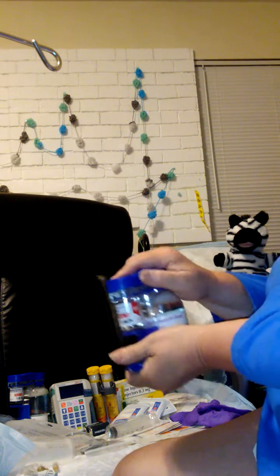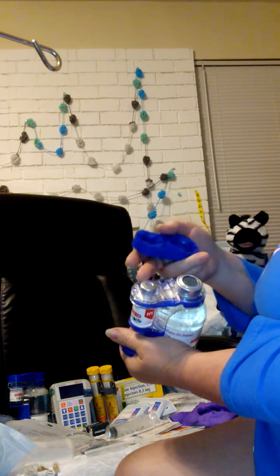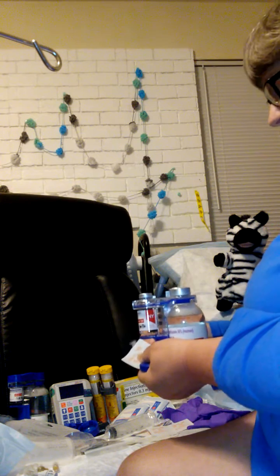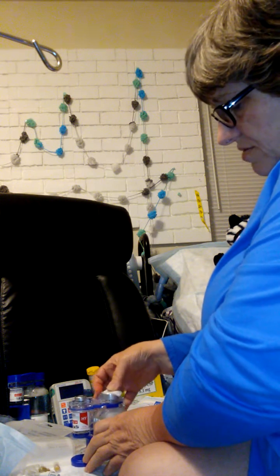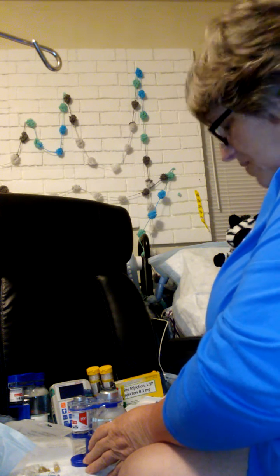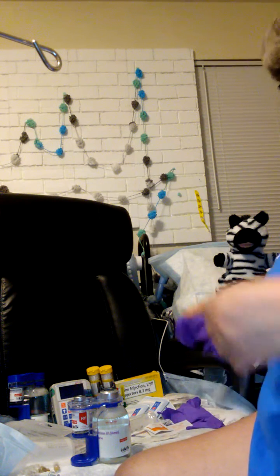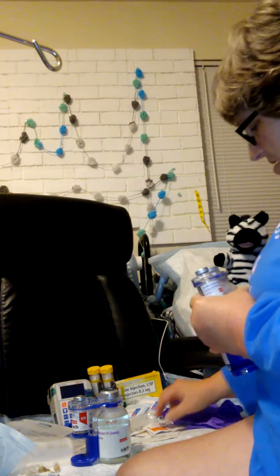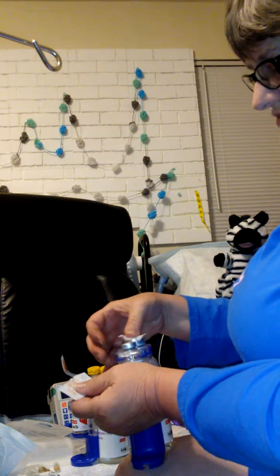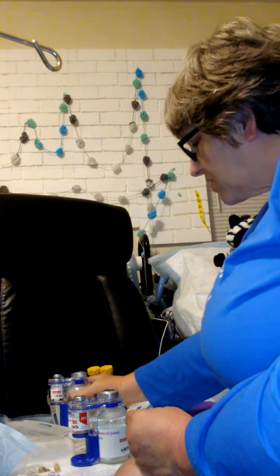First thing we're going to do here is remove this, and we have the tops of the vial. And it is very important to clean that. So I'm going to sit this down, and we're going to do a little cleaning here of these, just in case there's any kind of contamination. Okay. All right. Let me go ahead and do this one while I'm ungloved. I'm going to go ahead and do this one, and they'll both be ready for me whenever I get everything prepped. So these two, the lids have been removed.